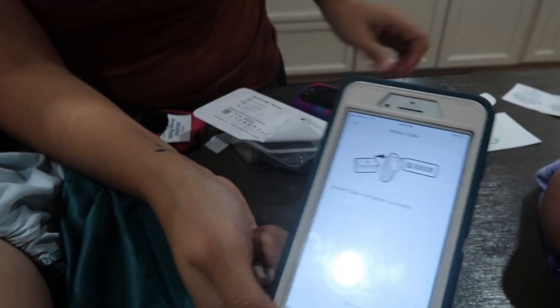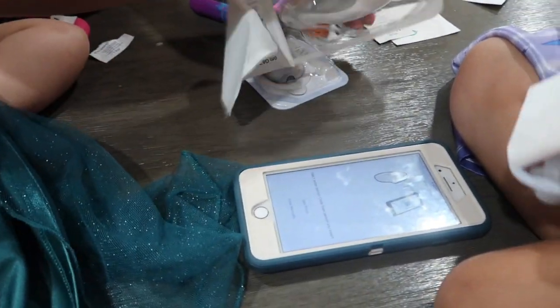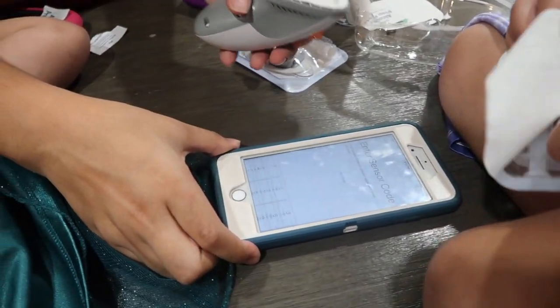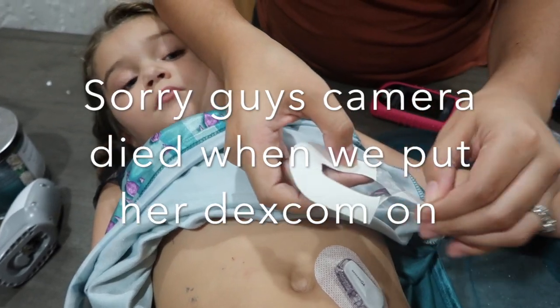We're going to do a new sensor. I'm going to enter the new code. Enter manually. 9311, save, confirm. And now we're gonna go ahead and do it. Okay, now let's put your sticker on.